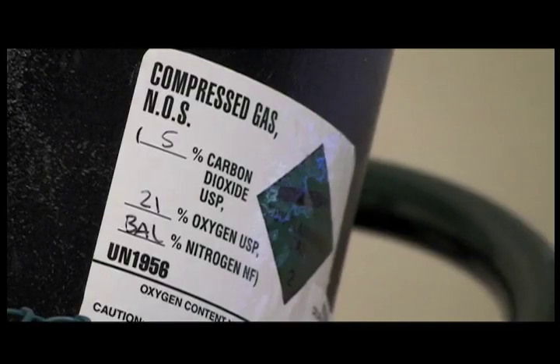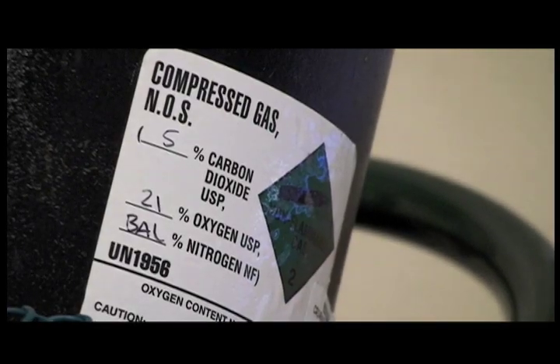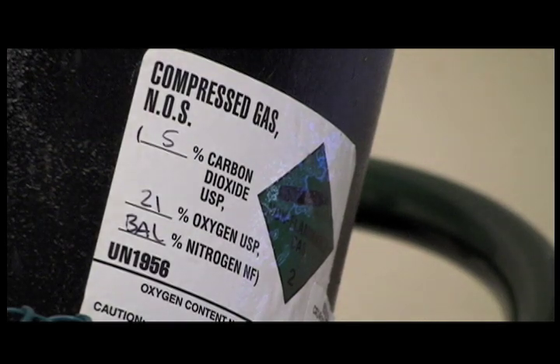EVH uses hyperventilation as a trigger for EIB and correlates well with EIB in trained athletes. EVH requires some, but not an excessive amount of special equipment. Most notably, EVH requires a gas tank that contains a mixture of medical grade air containing 4.9 to 5% carbon dioxide and 21% oxygen, with the remainder of the gas being nitrogen. This mixture is necessary to keep CO2 levels in a constant range over a wide range of voluntary hyperventilation.